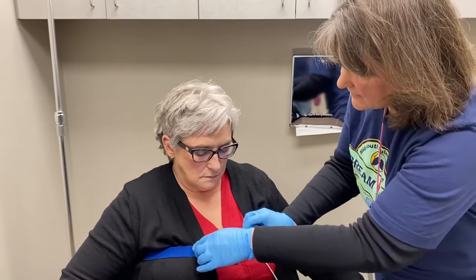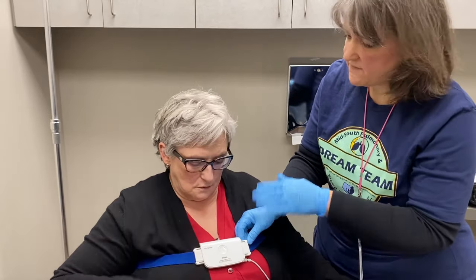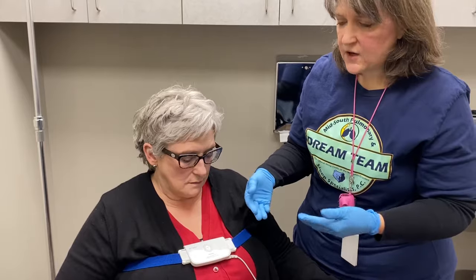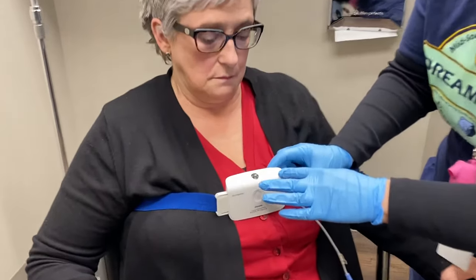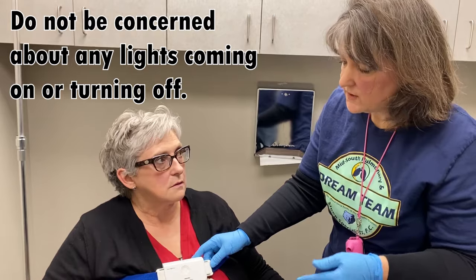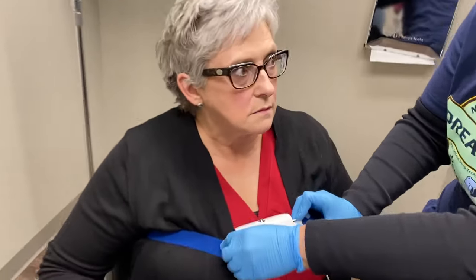By buckling that in, it actually starts your study — you don't have to push any buttons or anything like that. That button is a feature we don't use. By buckling in, that's actually starting a recording; we're getting a recording right now but we just discard it. You'll notice these lights that come on on the top — that's completely normal. They will light up and eventually disappear. They may flash orange if you move through the night, but as long as you have this locked in place, everything should be good.